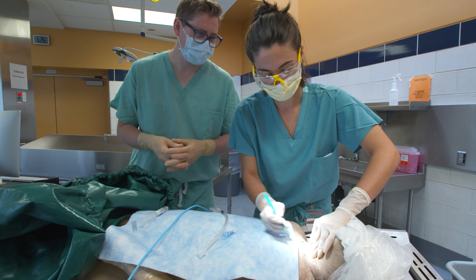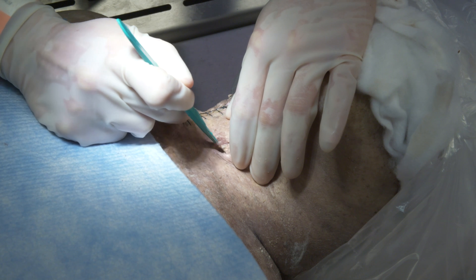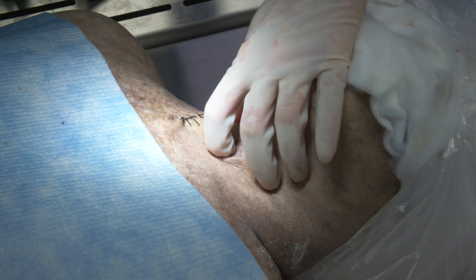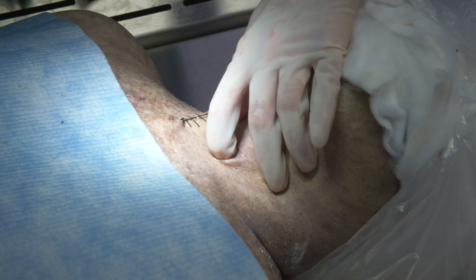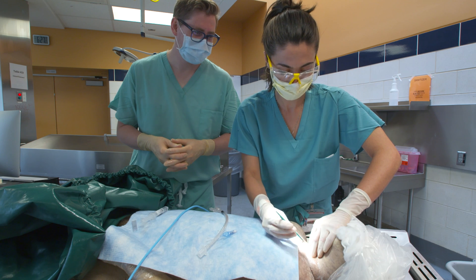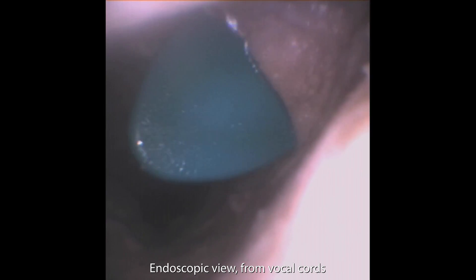Next, turn your scalpel 90 degrees and incise the cricothyroid membrane with a horizontal incision. One often feels a give or a pop when the airway is entered. You will also likely observe a gush of air or bubbles. It is normal for the patient to cough at this point, and blood will likely now be obscuring your view, but you can continue to rely on your palpation. Notice how Katerina keeps her finger in the wound to keep her place. The membrane incision can also be widened using either your finger or by inserting the handle of your scalpel and twisting.